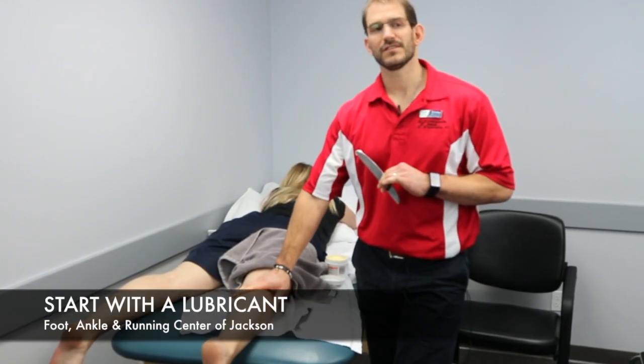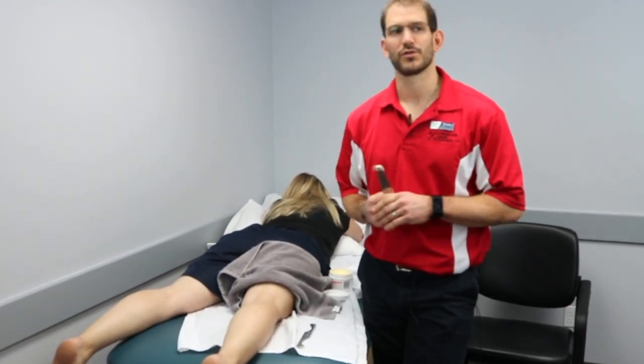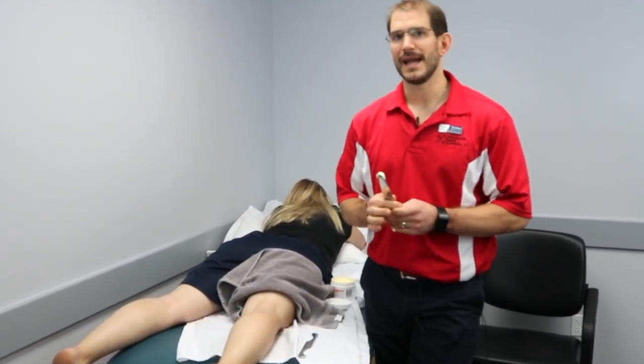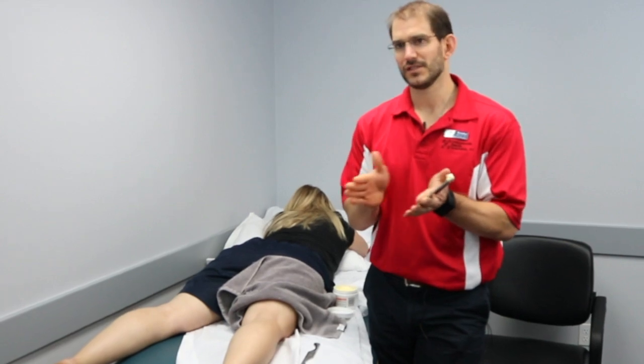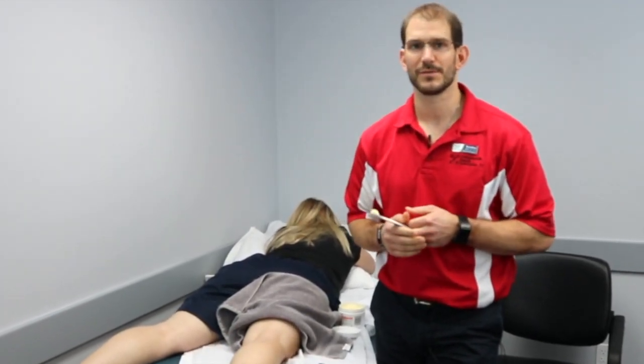This is a great treatment option to get blood flow, loosen up the tissues, and try to improve mobility so that we can work in a new range of motion. We always have to start by making sure there's something — some sort of lubricant — so the tool slides over the skin, which makes it much more tolerable for the patient.